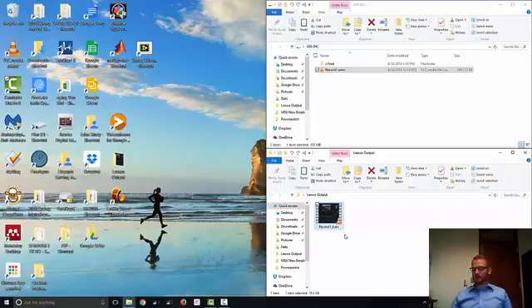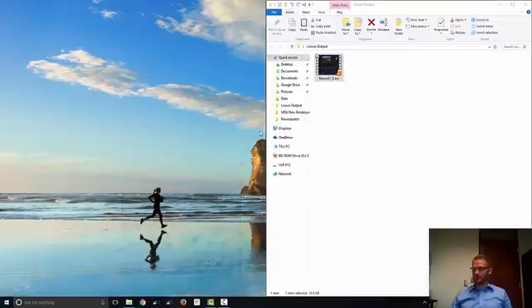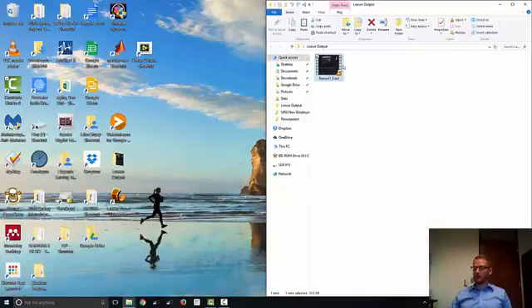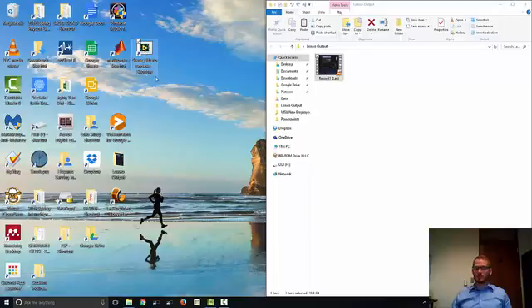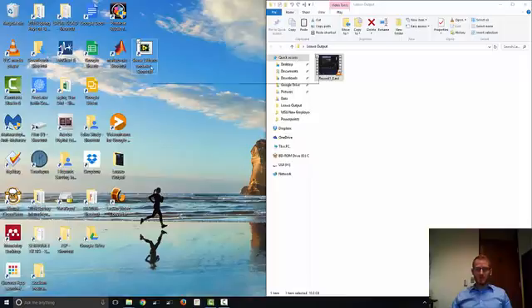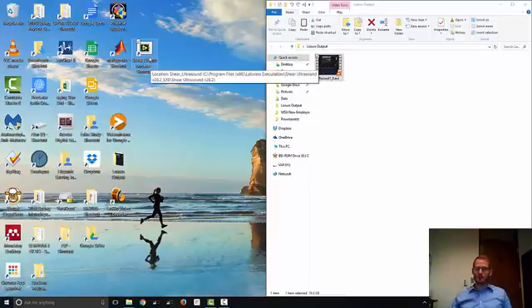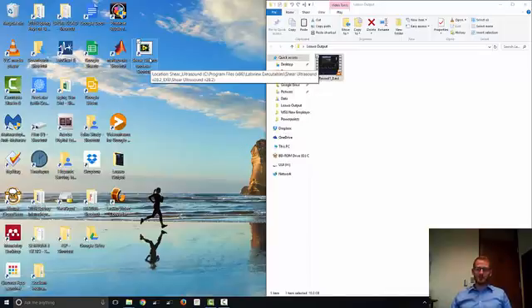In order to analyze this video, we're going to use this program here, shearultrasound.exe. A little background, this program was designed and edited by researchers at University of Missouri as well as the University of Delaware. So I did my doctorate at the University of Delaware, so I'm still using this ultrasound video analysis software.